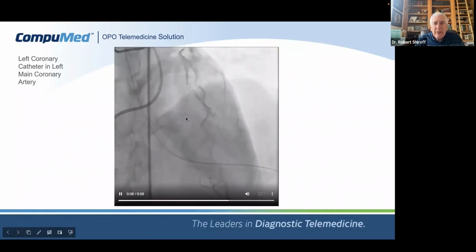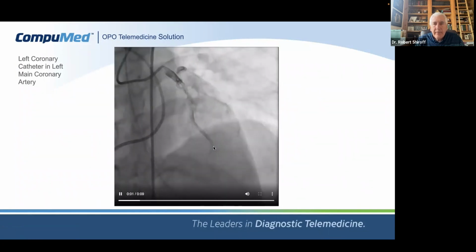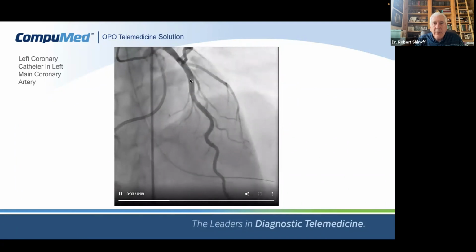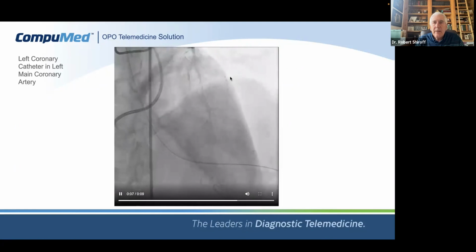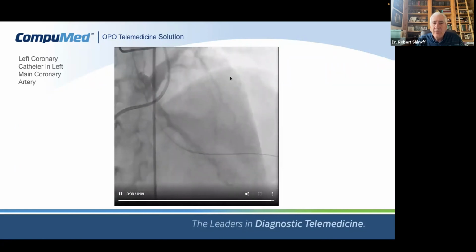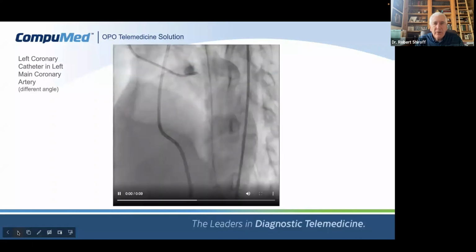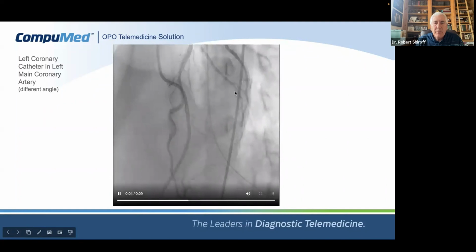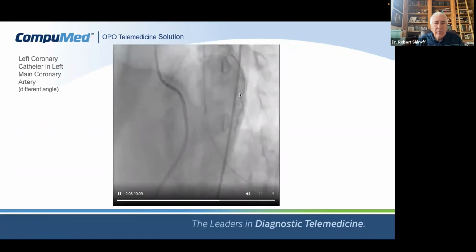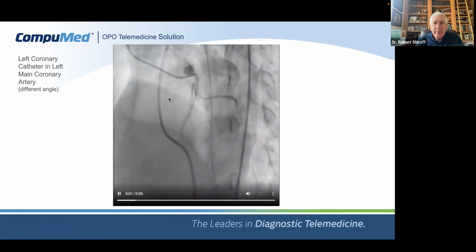This is the left anterior descending coronary artery coming down here. And the left circumflex is coming off, and it actually is going posteriorly. This vessel over here is actually behind the heart, and you're seeing it as if it was in the same plane because we're looking in 2 dimensions. I'll show you a couple more pictures so you can see better that the left circumflex in this view is now coming off the back of the heart. You can see here, this is the posterior wall, and here the left circumflex is coming back here, and the left anterior descending is over here.